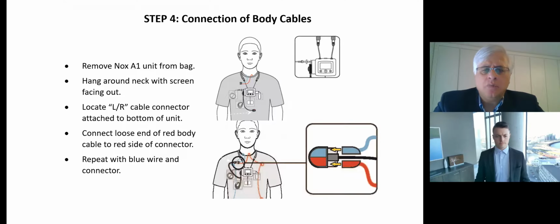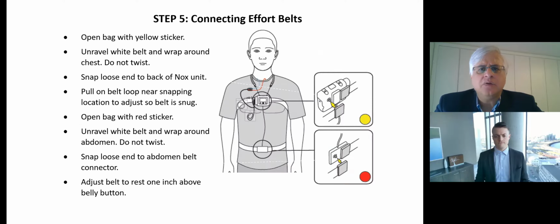We also walk them through any connectivity issues that they may need to go through. Everything is pre-set in the clinic before the kit is given out. So for example, the nasal cannula is connected to the Nox A1 monitor. The participant has to, however, connect the cables into the monitor itself. So they're relatively simple instructions that they can go through.